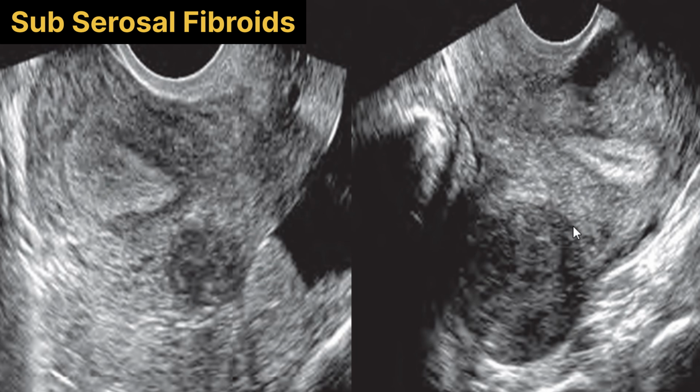Now this is a longitudinal transvaginal image of the retroverted uterus, and here we can see the endometrium of the uterus. This sonogram reveals a large hypoechoic, mixed echogenicity area which is away from the endometrium of the uterus, and this large fibroid is causing a prominent bulge in the outer serosal margin of the uterus. So this type of fibroid is a subserosal fibroid.